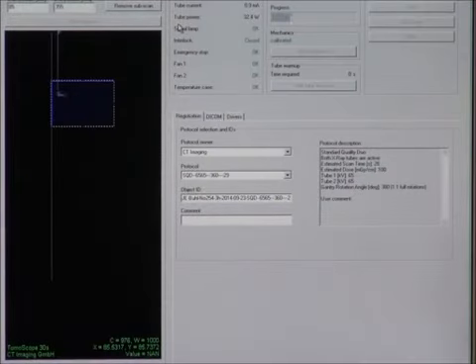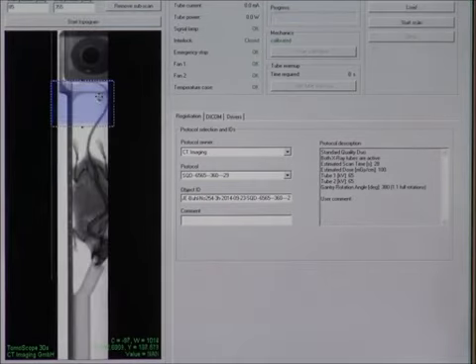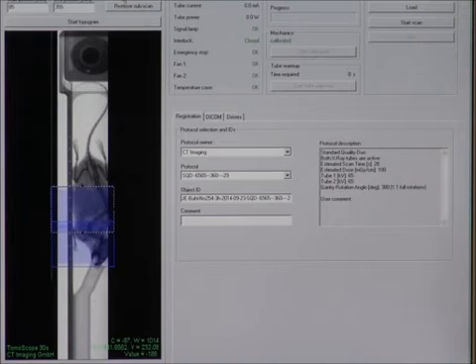At the µCT control computer, a topogram is acquired and shown. The windowing settings are adjusted to better see the mouse. 1 or more subscans can be placed. Their position is indicated by the light blue regions. Usually 1 to 3 subscans are sufficient.